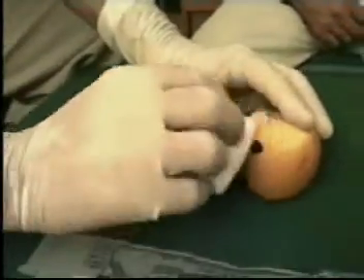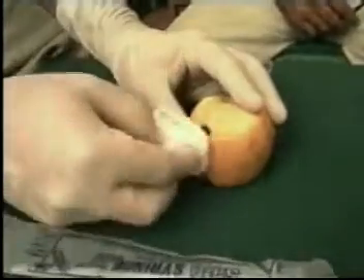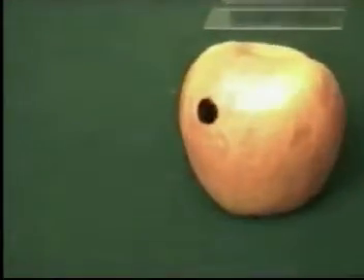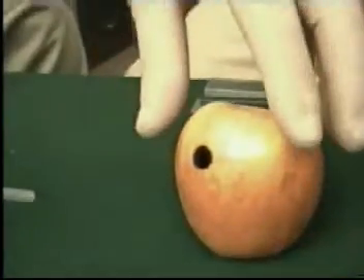The first step is that the operator should be wearing sterilized gloves, and with the spirit swab clean the area where you are supposed to perform the fine needle aspiration cytology. Once it's been cleaned, you can take up the syringe.